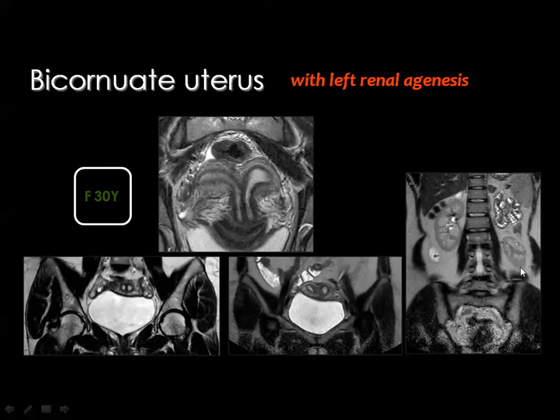The abdominal scans showed a single kidney on the right side with compensatory hypertrophy, with no left kidney present.